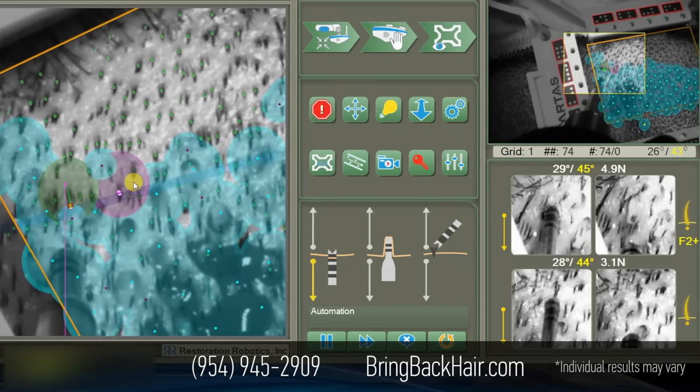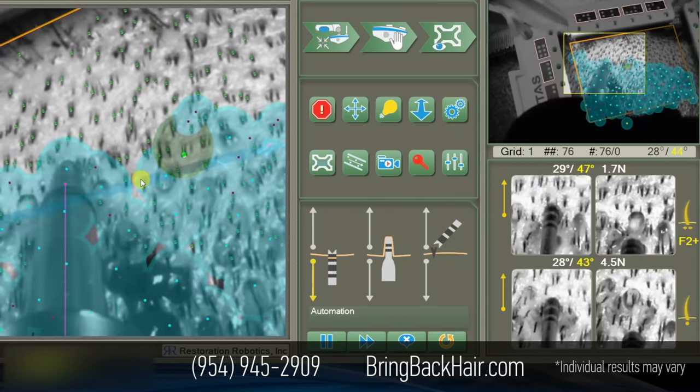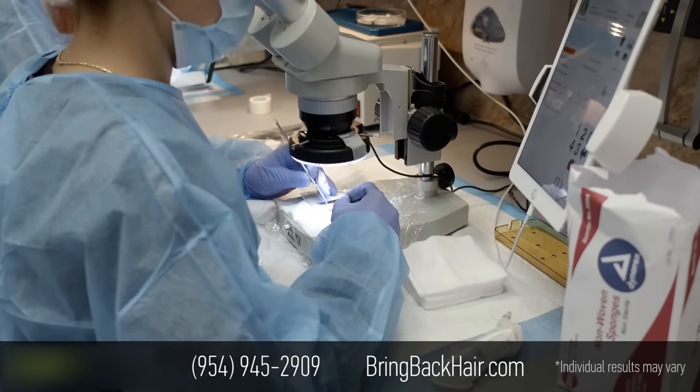The robot actually compensates for the movement of the patient, and goes right to the targeted area.